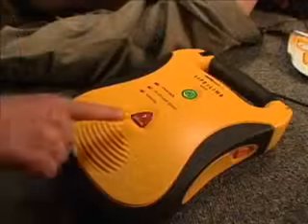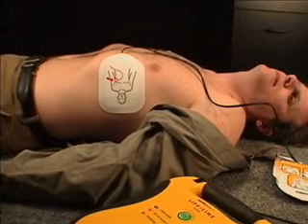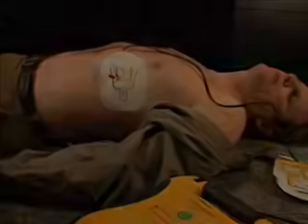Press the shock button to deliver a shock. The unit will confirm: Shock one delivered. It is safe to touch the patient. Begin CPR now.